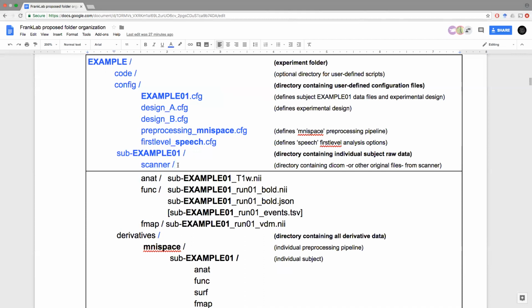So in my mind, what we will have is, in the study example, there will be a FreeSurfer directory, right? Does that sound reasonable? You mean here in addition to the scanner directory, another folder, like in the parent directory for the study?